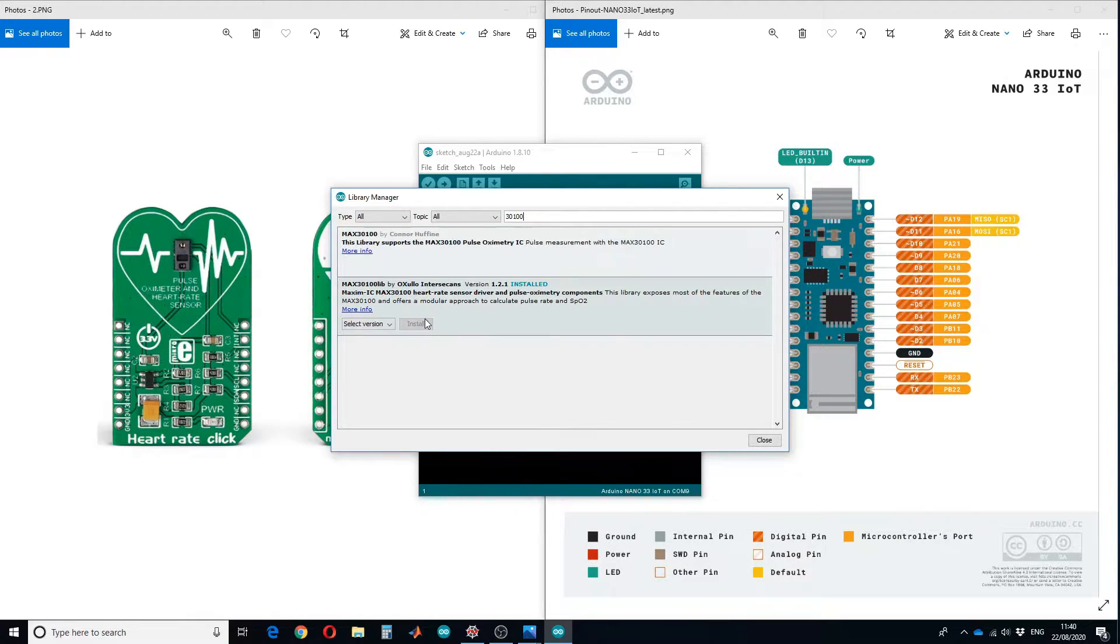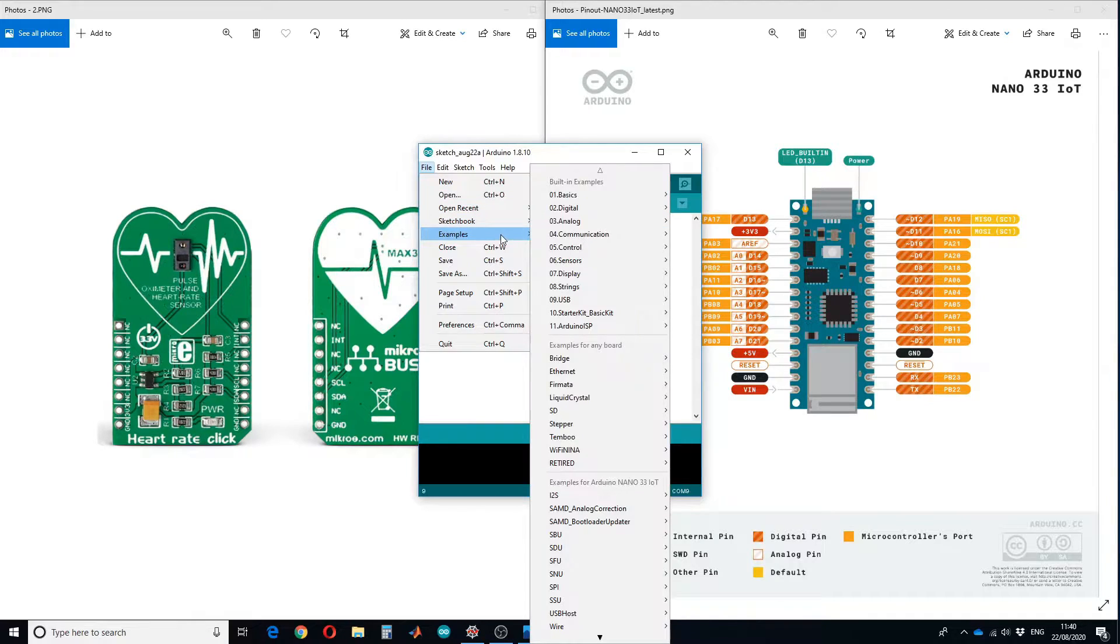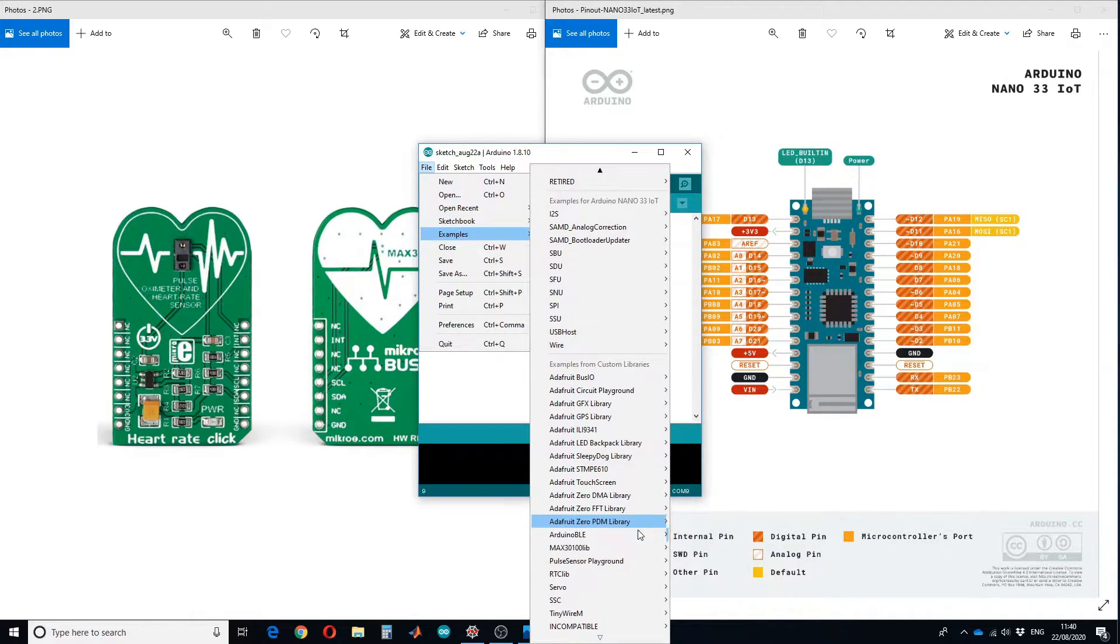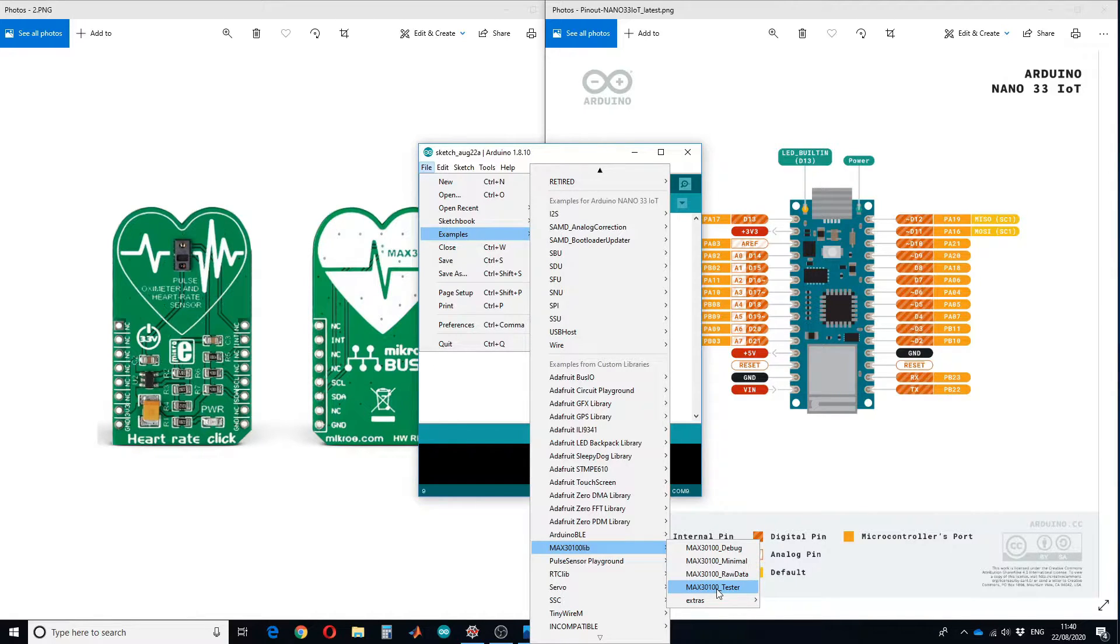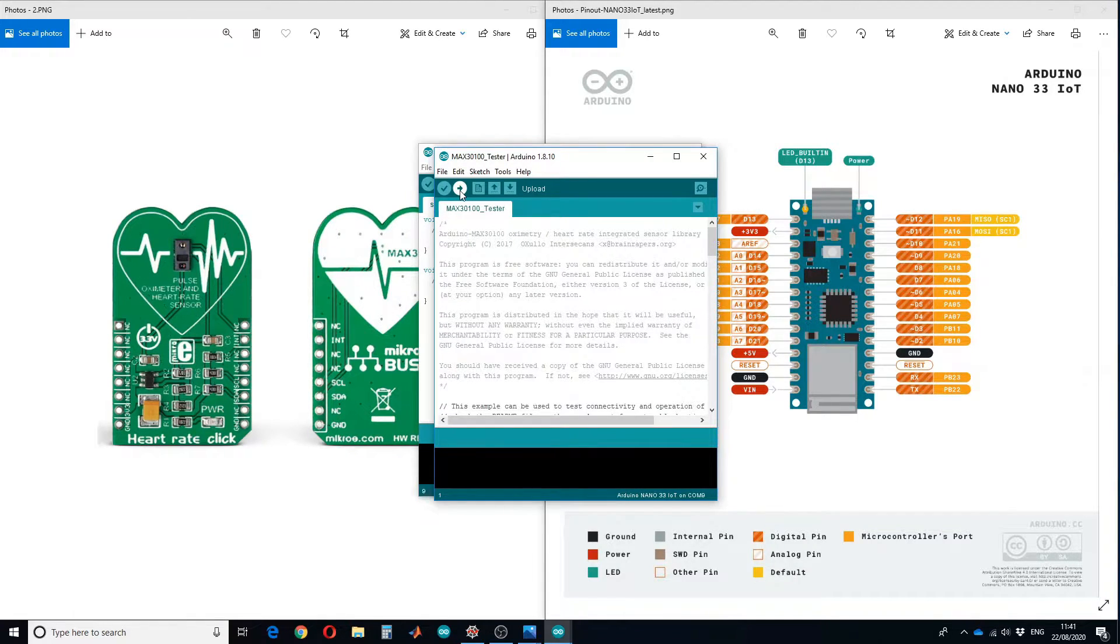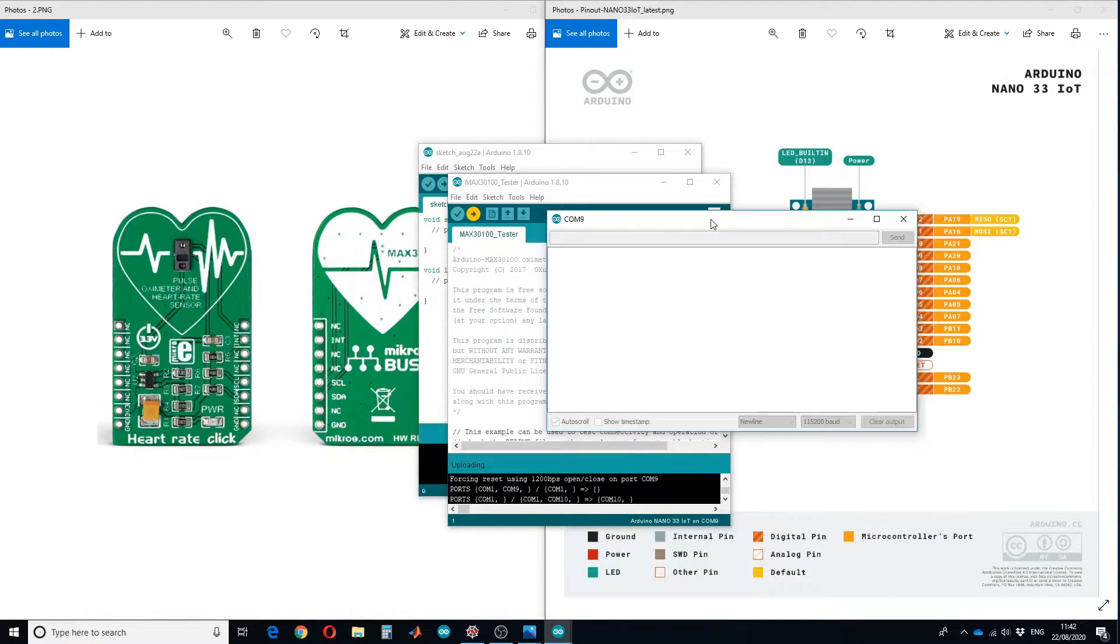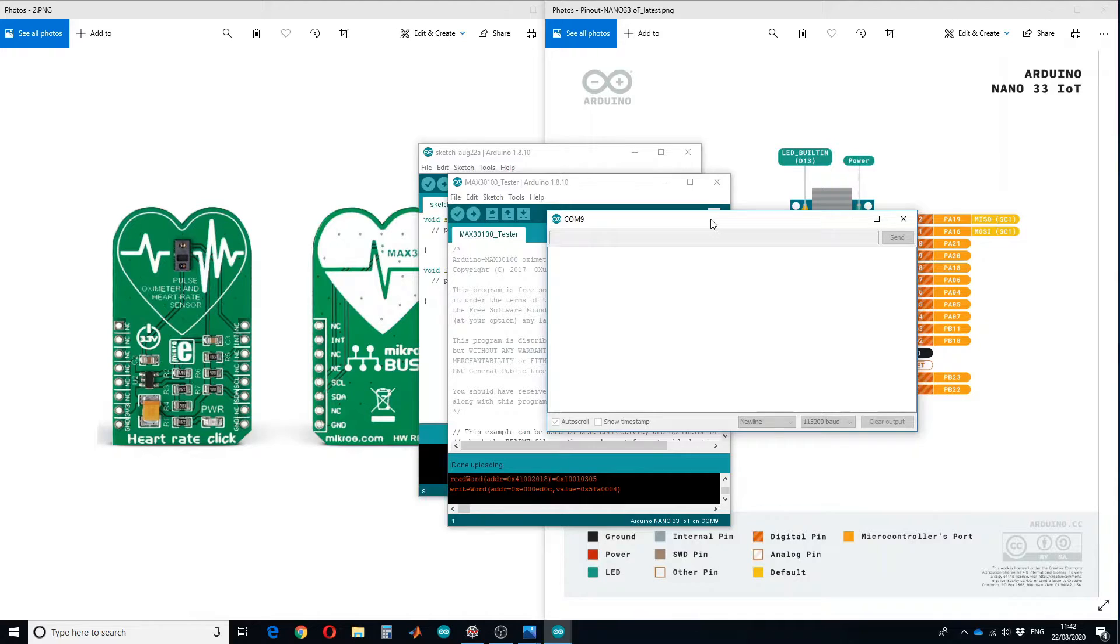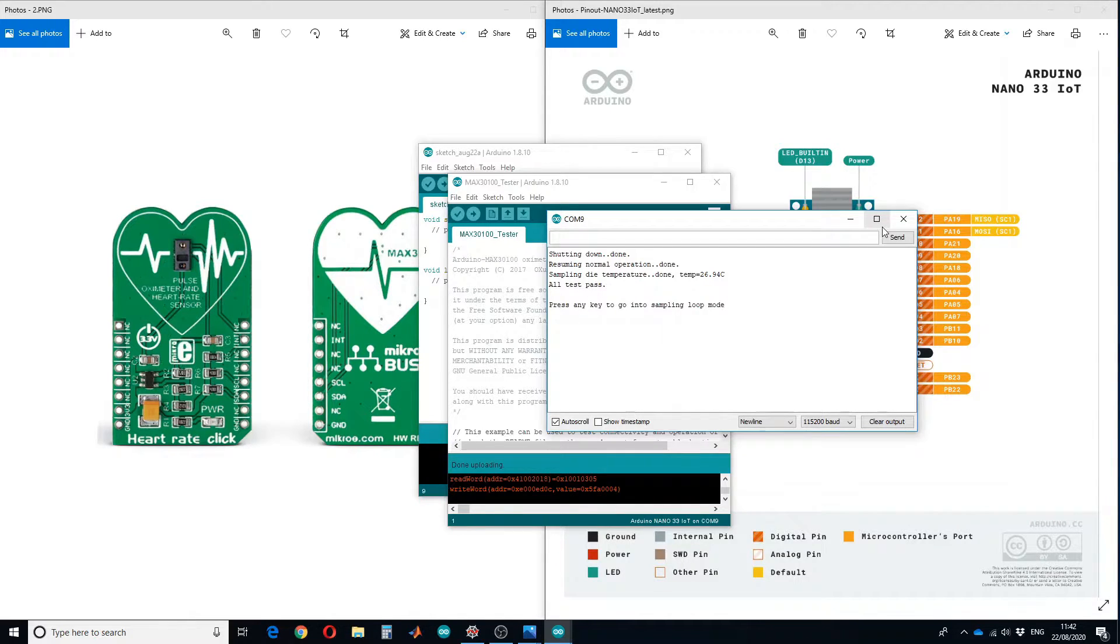Let's go to the third step. We are going to open an example. Go to File, Examples, and MAX30100 Lib. First you have to test your connection, so open this tester file, connect your Arduino Nano with the computer, and upload the code. Open the serial monitor. It will automatically run different tests and show you that all tests have been passed. This means all connections are correctly done.